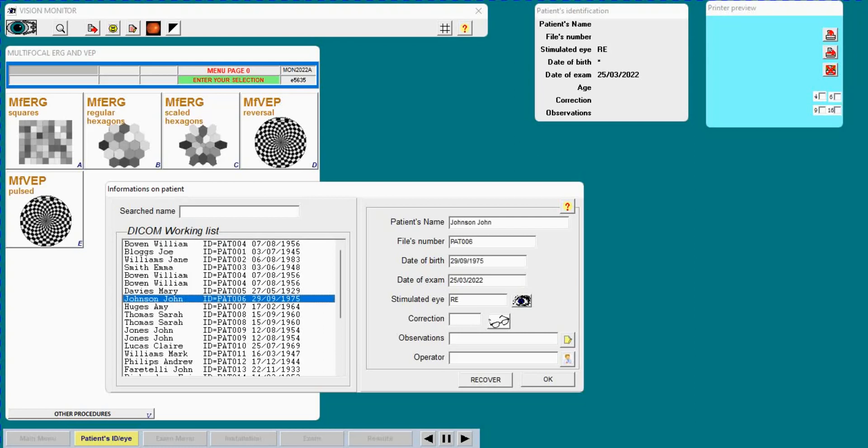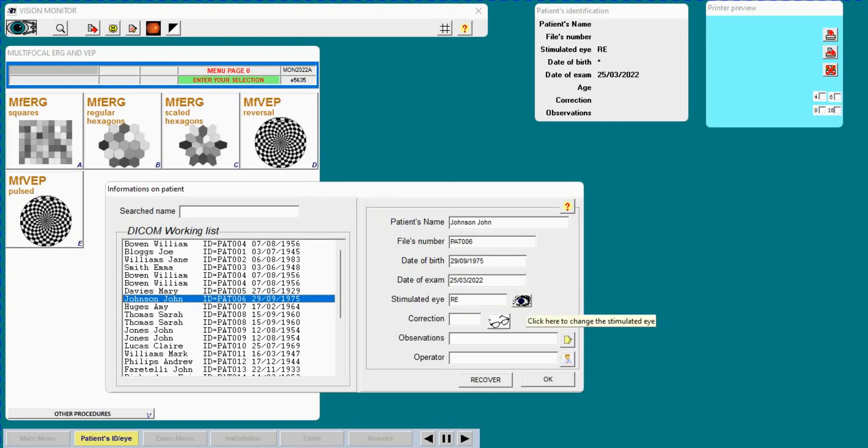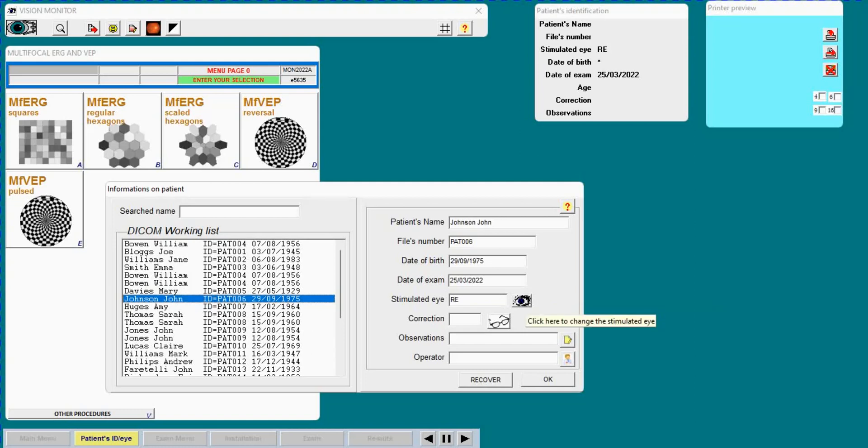Automatically I get the name, date of birth, file number, and next I will select which eye I am going to test. I have a choice between binocular or monocular right eye or left eye. I usually prefer to do the exam monocularly to avoid loss of fusion in the middle of the exam.